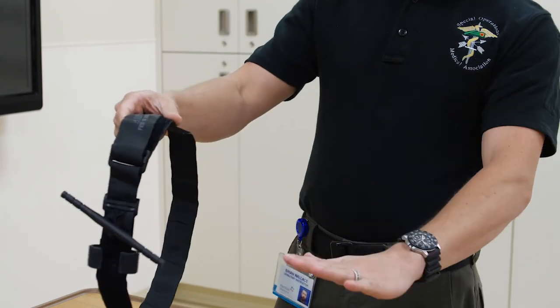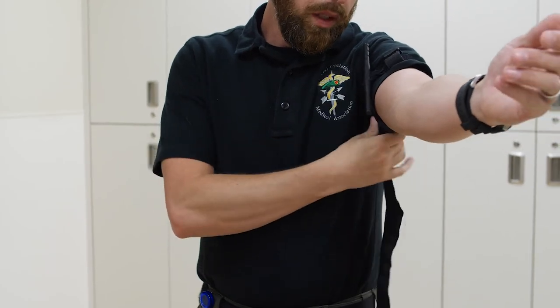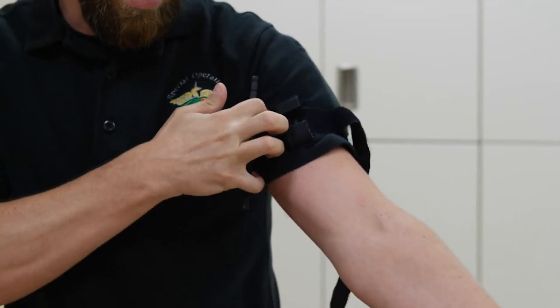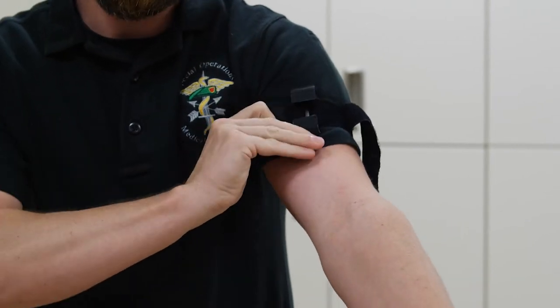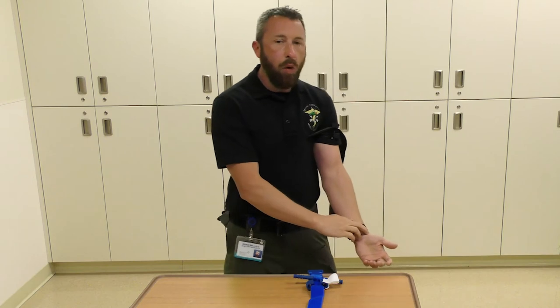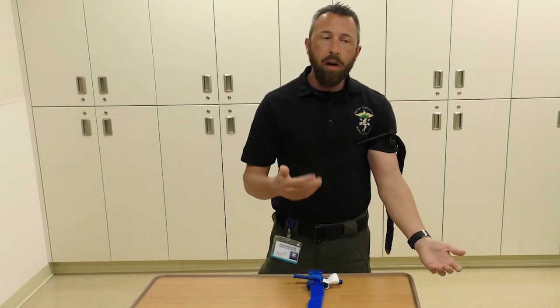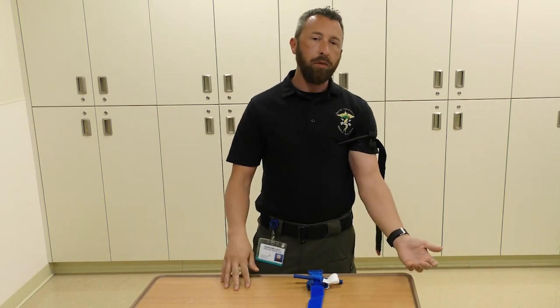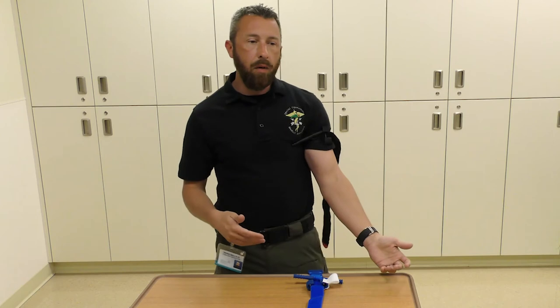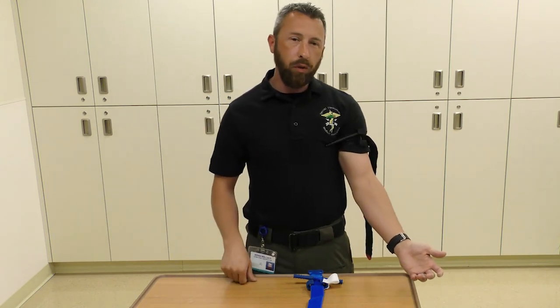Slide the tourniquet over the injured arm, grab the velcro, pull it tight, and keep the windlass close to you. Once you get most of the tension out of the velcro, bring it back on itself about three-quarters of the way around. Access the windlass and spin it. People always ask when to stop spinning — the answer is when the bleeding stops or there is no more radial pulse. The textbook says a tourniquet can be placed for two hours or more before there is any damage to the limb.